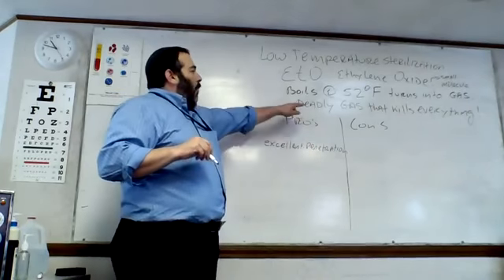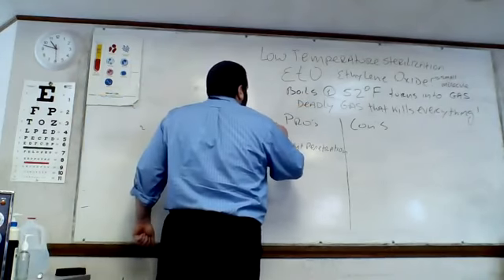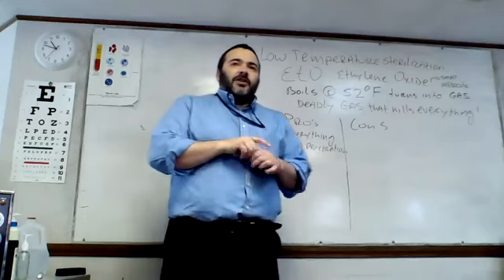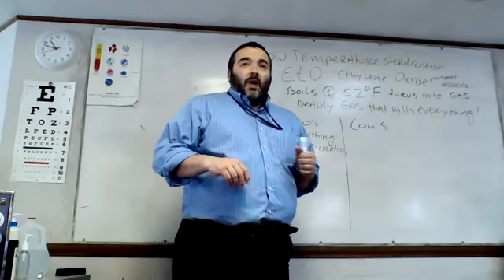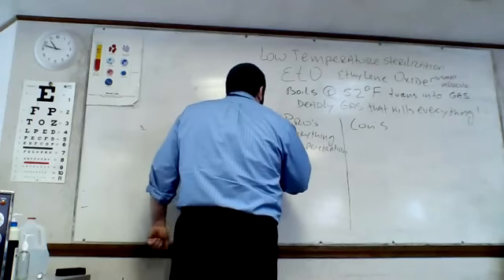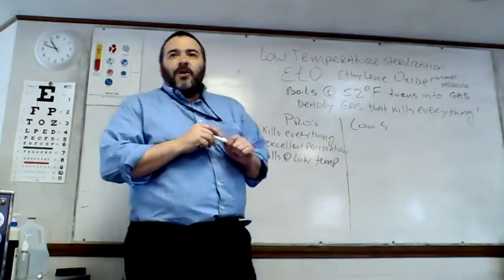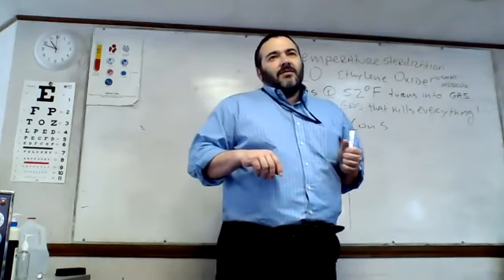And you know what? One of the pros is that it also kills everything. I'm going to put kills everything right here. We'll list it first. Excellent penetration. You know what else is good? We already have an answer on the board. It does it at low temperature. Kills at low temperature. Why is that important? Well, because high temperatures sometimes warp delicate instruments.